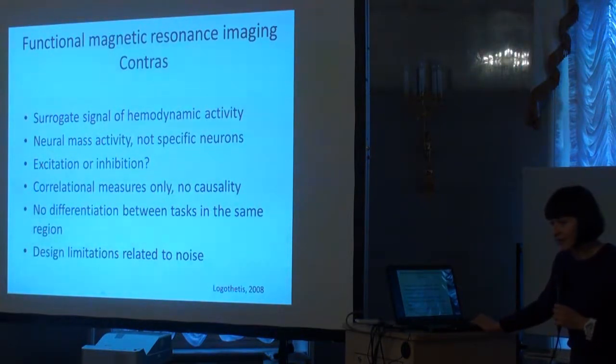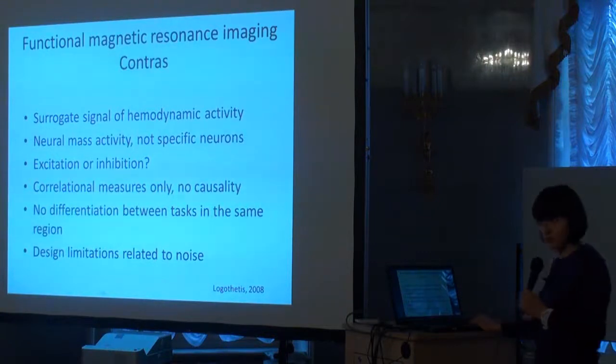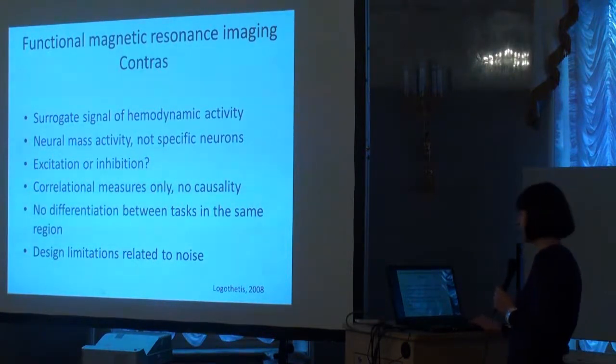if you go a little bit deeper, it means that when blood flow increases, it may be excitation or inhibition in the brain. It doesn't matter. It all depends on neuromediators. So you don't know the nature of the process which occurs in the brain. There is some work of neurons, and there is an increase in blood flow. This is all that you know. So there are quite a few assumptions behind the technique.